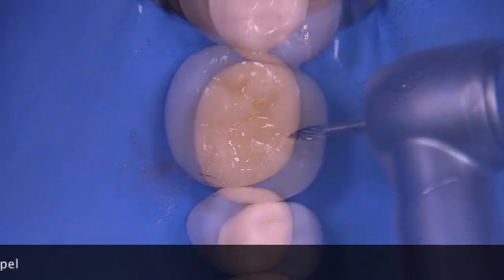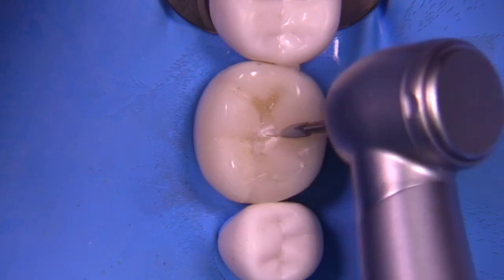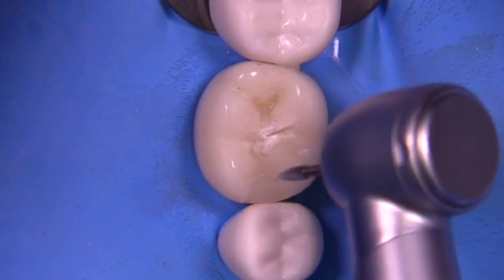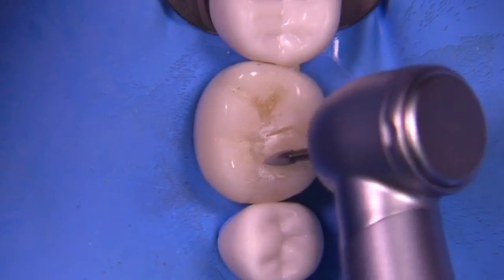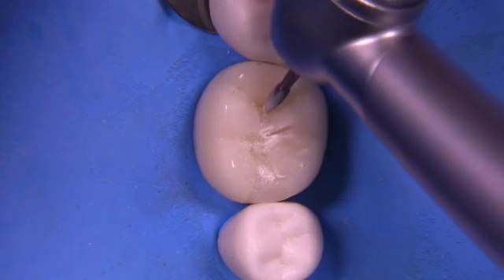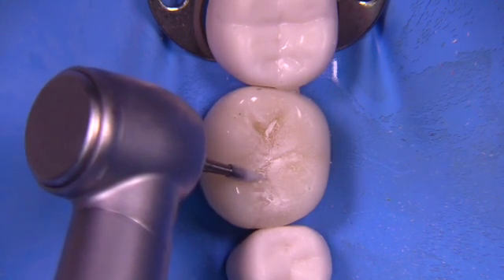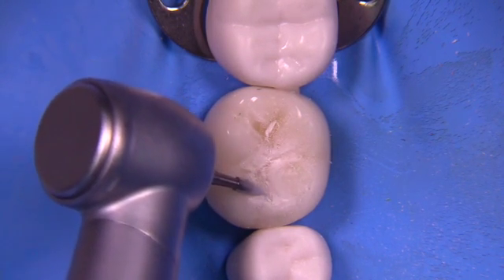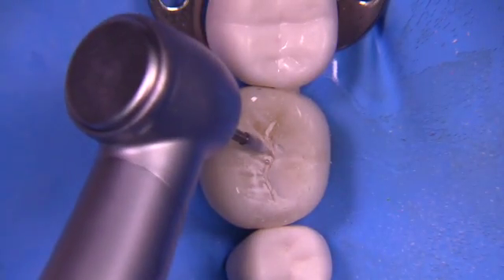At this point we can utilize the 7102 carbide. This is an amazing carbide because it works really well with a pointy end in the groove areas, and I like to always start in the groove. Start in the negative zones, not the positive zones. You want to utilize this bur to create the tracking of the central groove and the grooves that go off between the cusps, so that we can then have a reference point upon which to contour the more positive areas like the triangular ridges. This technique has worked extremely well throughout my career in maintaining ideal anatomy that really follows the anatomy of the tooth itself.